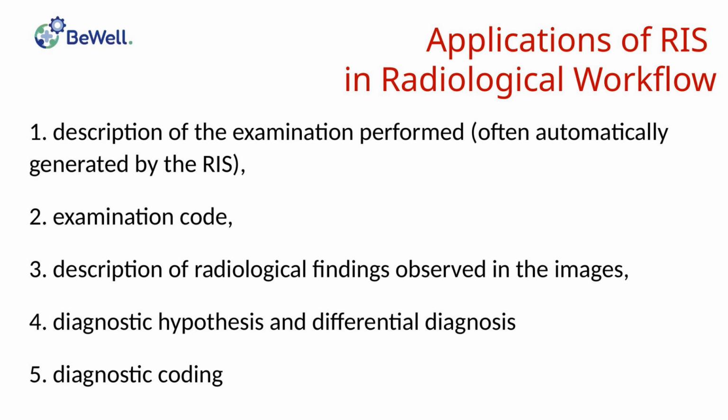And now, focus on reporting and delivery. After the examination, the RIS assists in the interpretation of images and report generation. This is done through the following methods: compiling a reporting list to establish the priority of reports, for example, based on the referring department or the interpreting radiologist, displaying previously performed examinations by the patient, known as the radiological history, and displaying electronically archived reports of previous examinations.